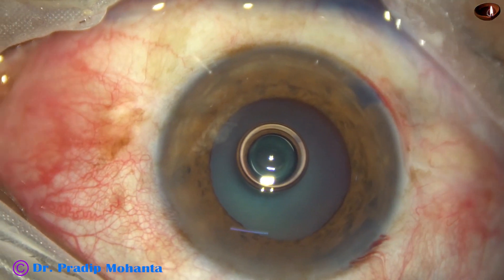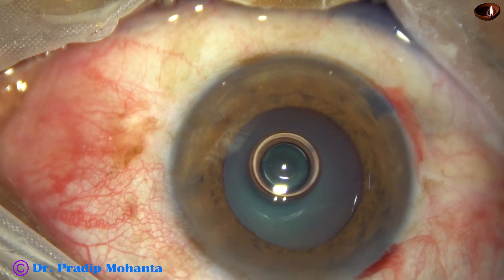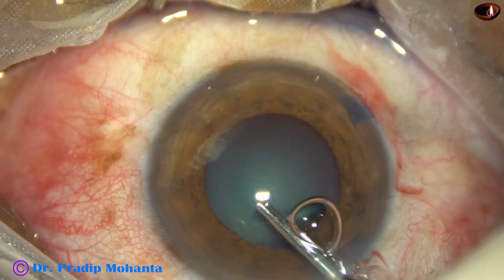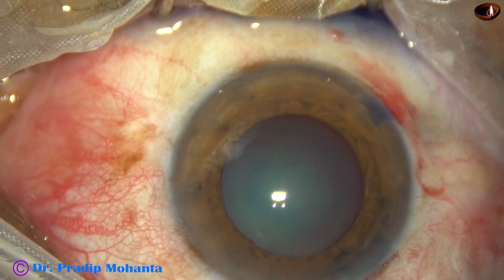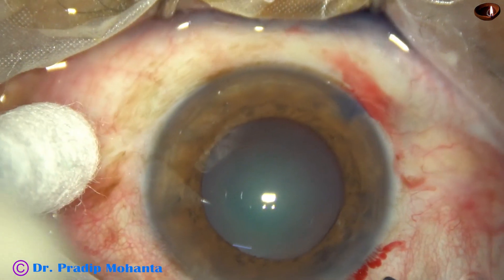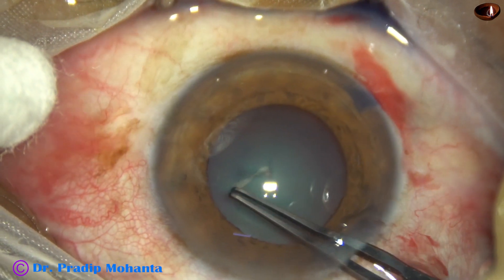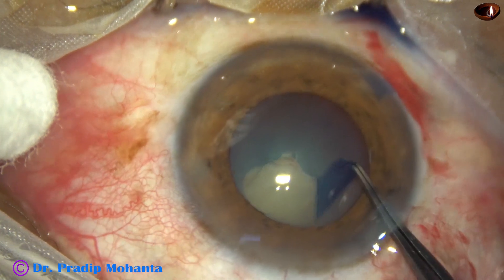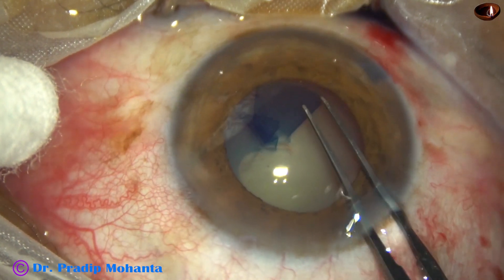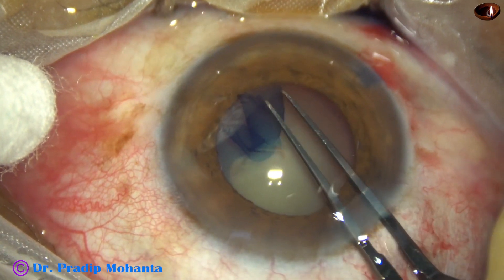Now let us see this case. In this case, the anterior capsule has already been stained. Viscoelastic goes in and fills the anterior chamber. Now it is the time to introduce the utrata forceps. As we enter into the anterior chamber with utrata, the anterior wall of the main wound is lifted up and the rest of the job is done keeping the utrata forceps lifted up.